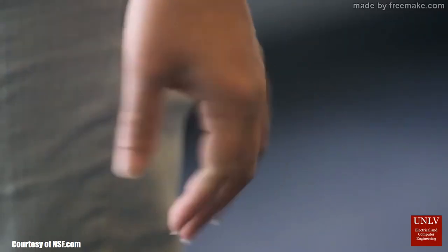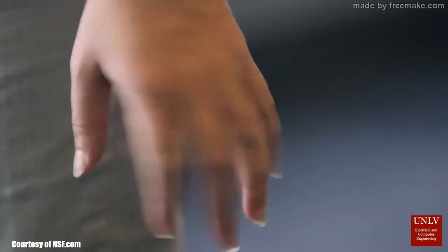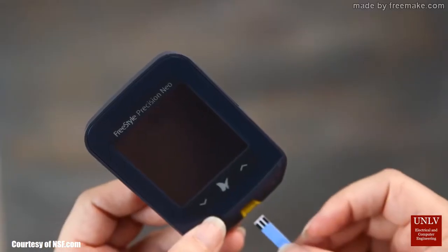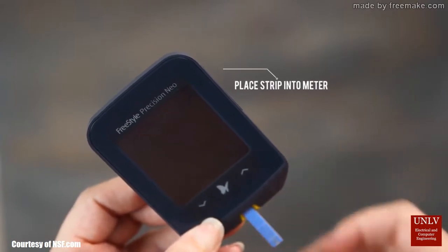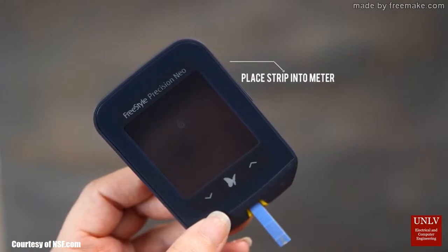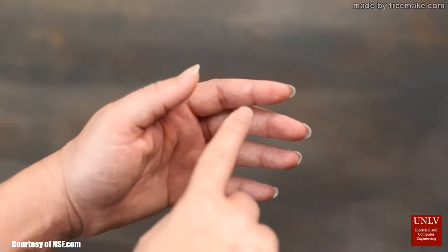Poking needles, disinfecting wipes, bandages, a little pouch to carry all those things — plus the hassle of having to switch fingers every time you get tested to avoid bruising. Not to mention the blood.